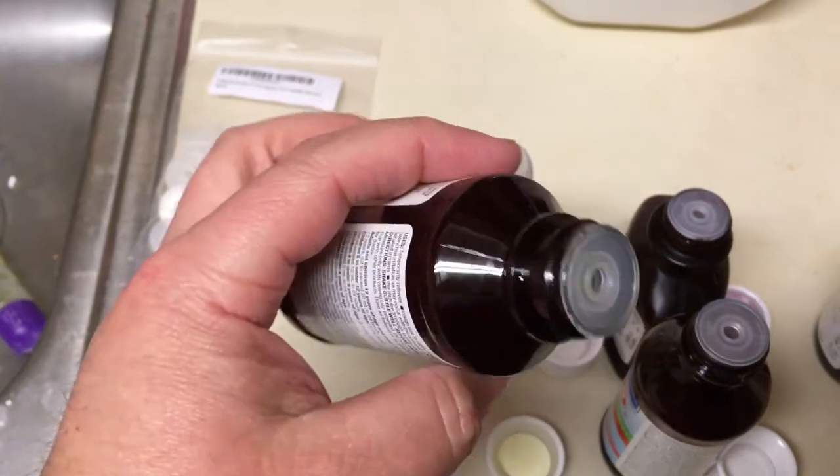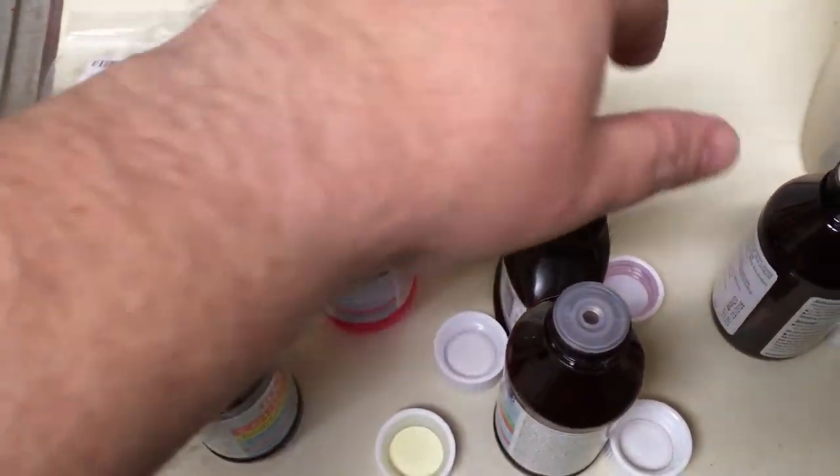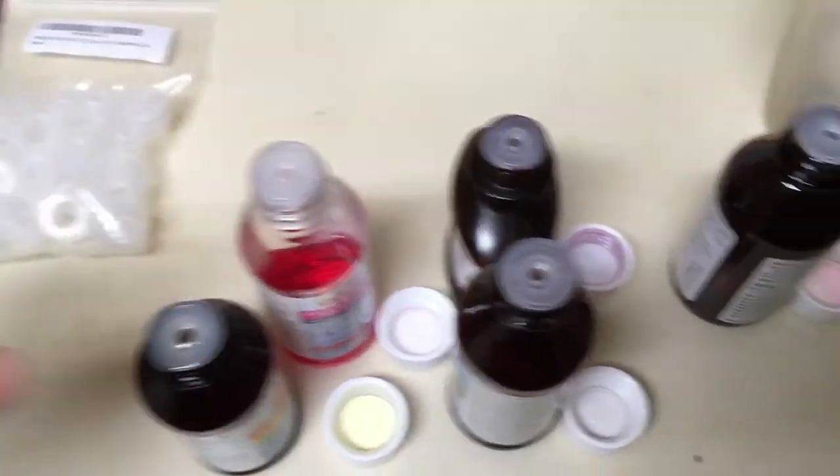So we got just a standard medicine bottle from the store for our kid, and let me keep these by the lid so I don't get them mixed up.